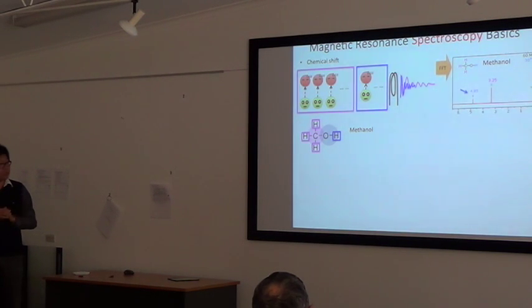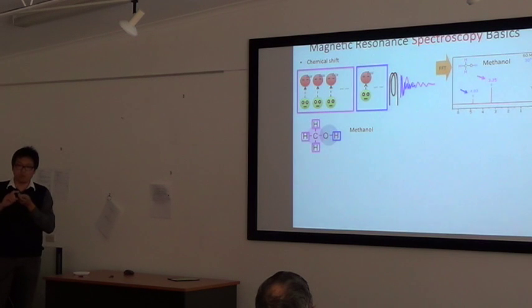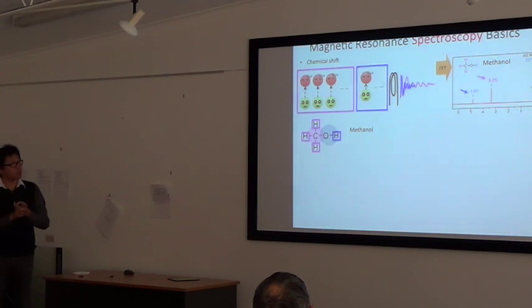The blue peak indicates the relatively faster relaxation, if you like, and the pink one indicates the other. So we get the shift on the frequency domain, which is purely dependent on the relaxation period, which is dependent on where they're located on the molecule. So that's why we call it chemical shift.